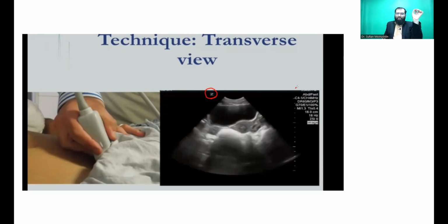Normally, suppose you have kept the patient, so this is the patient, this is the right side, this is the left side. You see that the marker is on the right side of the patient. That means this ovary belongs to which side? This ovary is of the right side, and this ovary belongs to the left side. Remember that many times, due to hurriedness or sometimes abnormal holding of the probe, people often confuse right with left, left with right, and mistaken reports come out in the market. Okay.